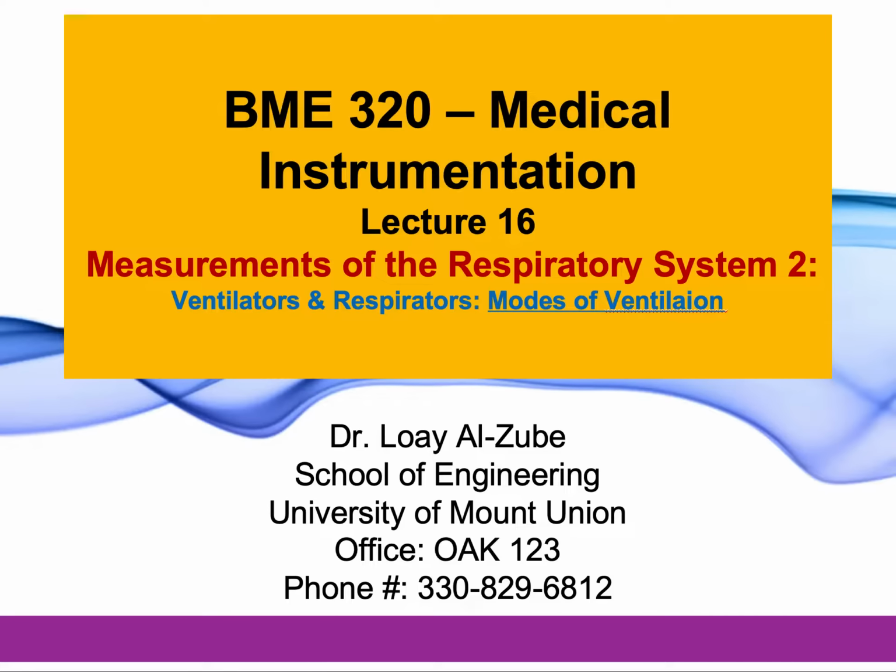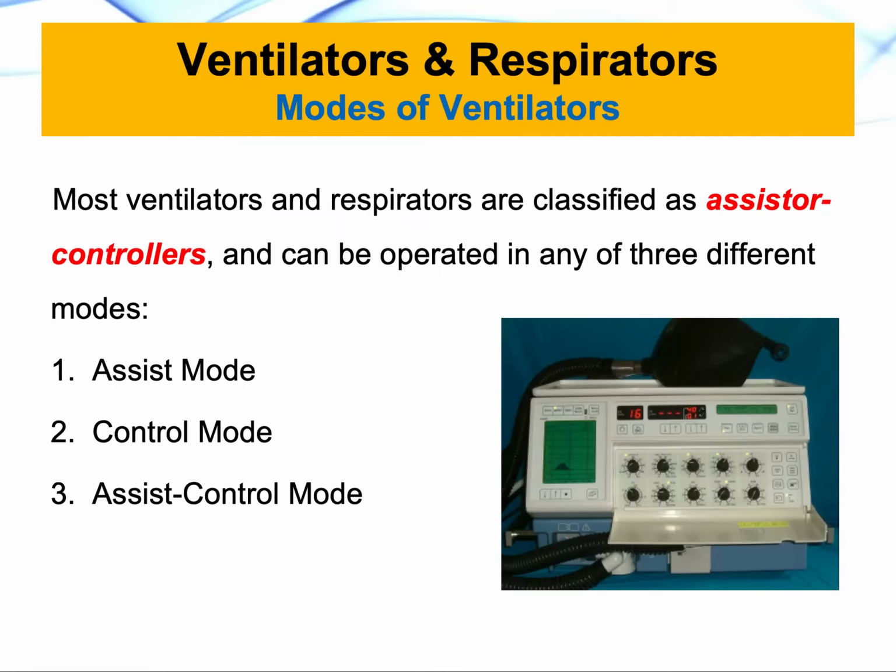We talked about ventilators and respirators and inhalators in the previous videos, and we talked about all the cycles, so the flow, volume, time and pressure cycles, as well as the volume and pressure control modes for a medical ventilator or a respirator. Now I would like to go into the modes of ventilators.